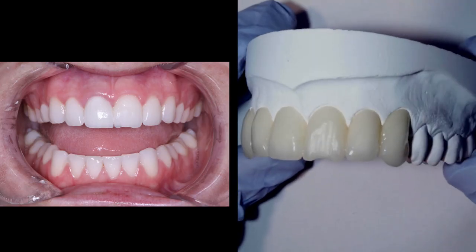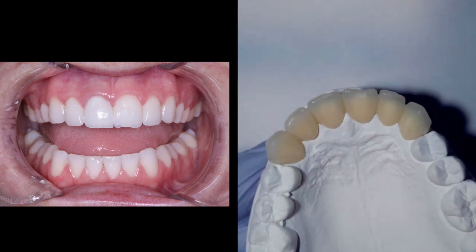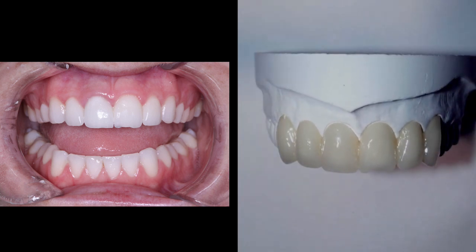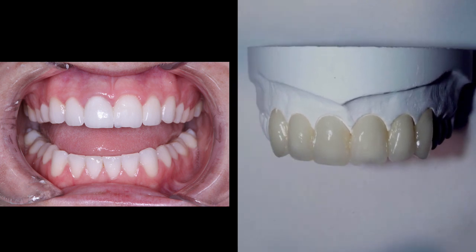This is where you still want to remember: take a diamond and roughen it up. I don't want to just repair one little area, because if the patient bites into something it's going to pop off. You want to bevel it a little bit. So you've got your diamond roughing it up, your micro-etcher, and now you're going to do your hydrofluoric acid. You've got to know those steps. Here's the fracture — you can see it's kind of sheared off. I took a little diamond and roughened it up. In the States I can't use a high-speed handpiece, so I have to get my doctor to roughen it up.